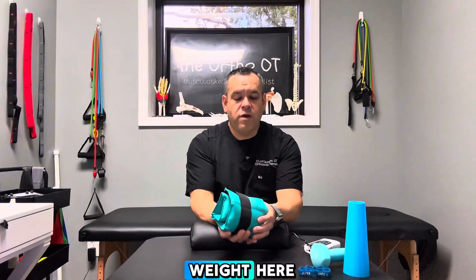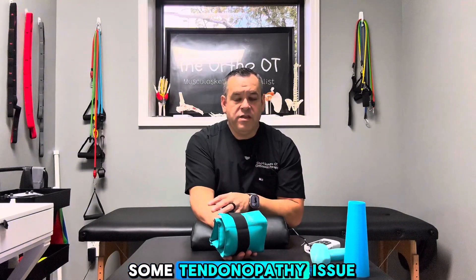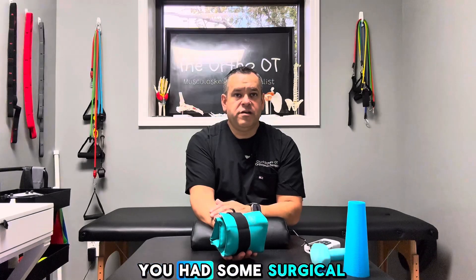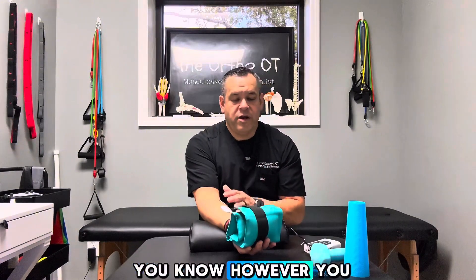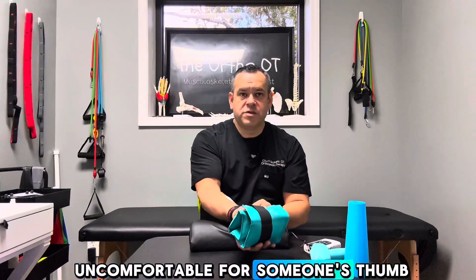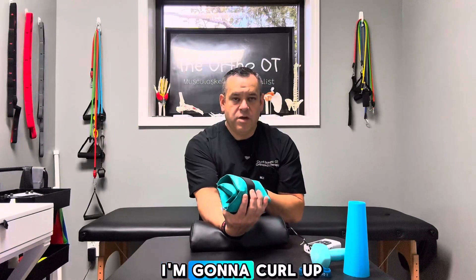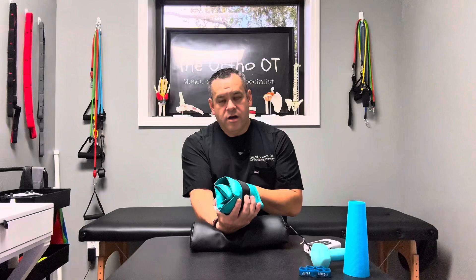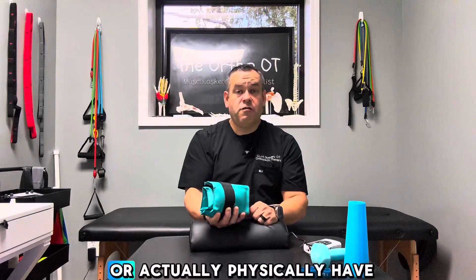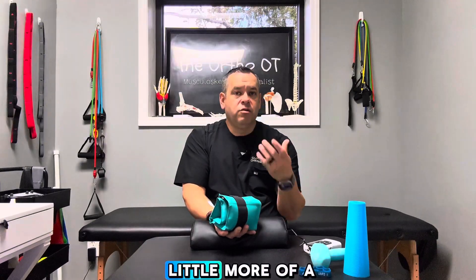Then we're going to go over to a rolled-up cuff weight. This is a pretty heavy cuff weight, especially if the person has had nerve injury, tendinopathy, carpal tunnel, surgical repairs, post-fracture, or various other conditions — so you want to be careful not to do something too heavy too soon. We're going to hold this in a general grasp. When the stem kicks on, I'm going to curl up. I would also have the patient practice reaching forward like they're going to place it on a shelf — or actually have them place it on a shelf. When the machine kicks off, they relax. If I had several cuff weights, I could have the patient pick them up, reach, and let go — just to simulate a more functional movement.